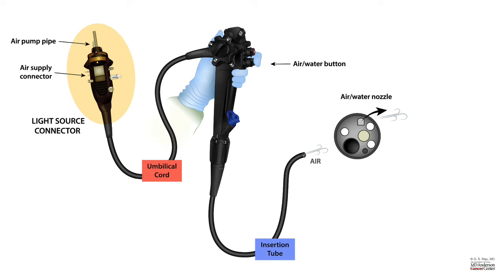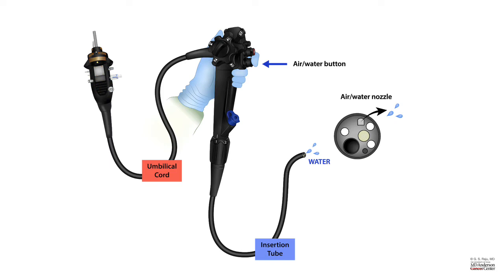If you press down on the air-water button, small amounts of water comes out, and this is used to clean the lens. And where does this water come from? Again, close to the light source connector, there is a water supply connector, and that's where the water comes from. And we will trace the channels that take air and water along the umbilical cord and insertion tube.